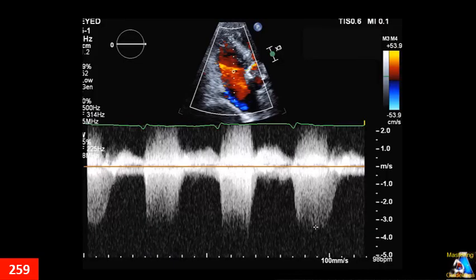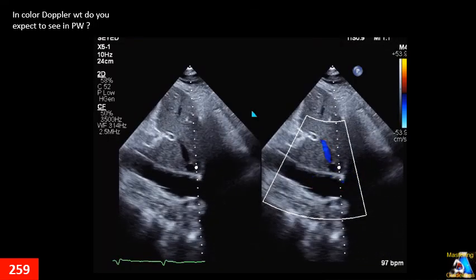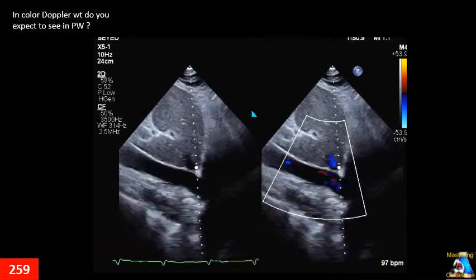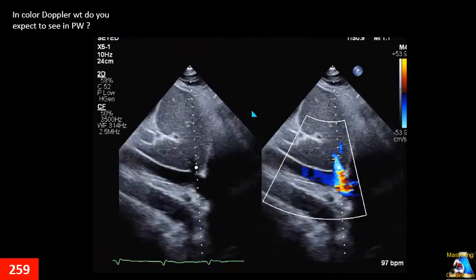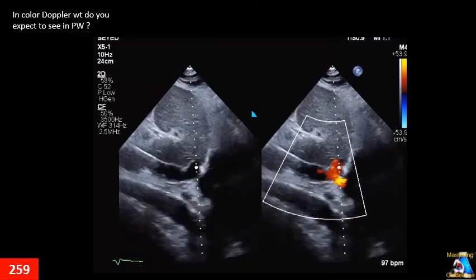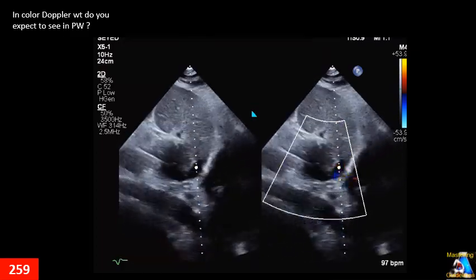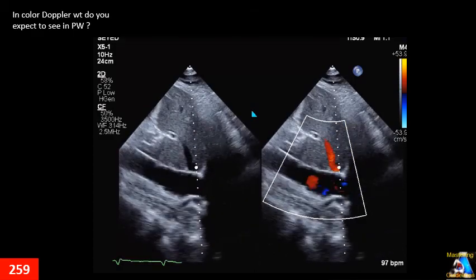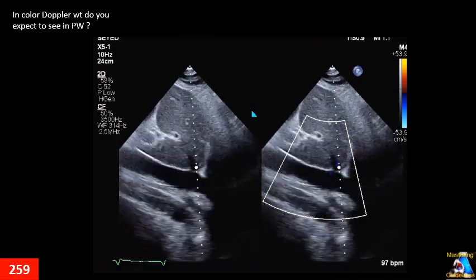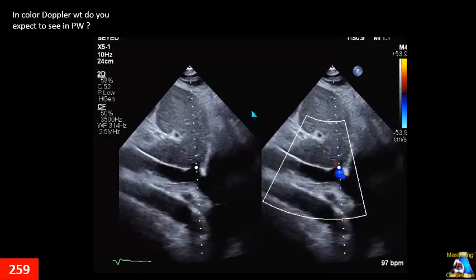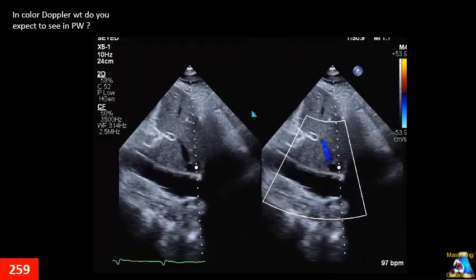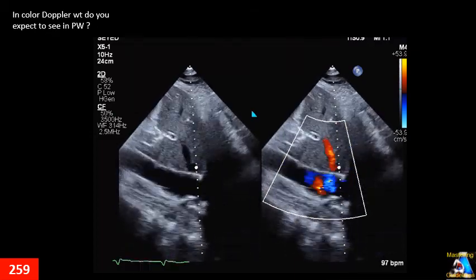You are scanning a patient and on the subcostal view you get such a Doppler pattern. When you see something like that, what should you be suspicious about? Here is another case: you are scanning a patient with significant tricuspid regurgitation (TR), and you want to do color Doppler on the IVC and hepatic vein. Based on the color Doppler, what type of pulsed wave Doppler would you expect to see on the middle hepatic vein?